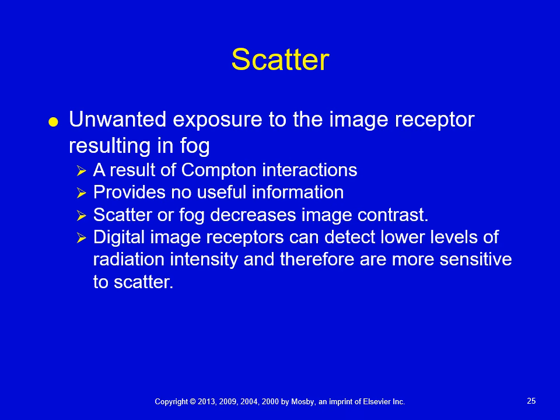Now, our digital systems, or digital image receptors, are very sensitive to scatter. So even small amounts of scatter can decrease the contrast in those images more than it did back in the film screen days.